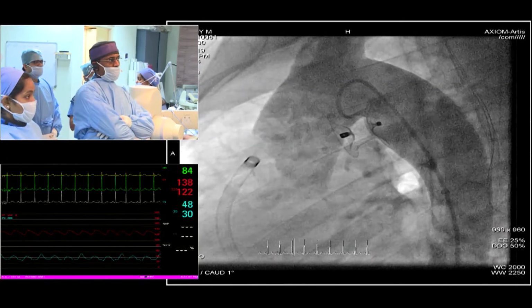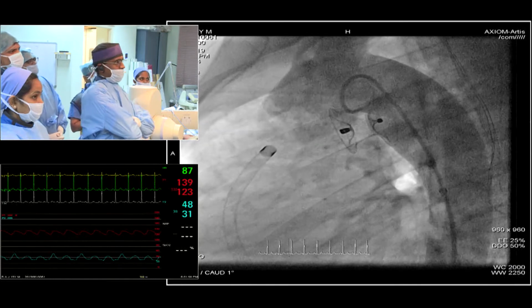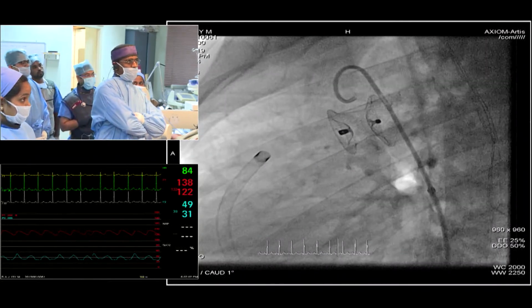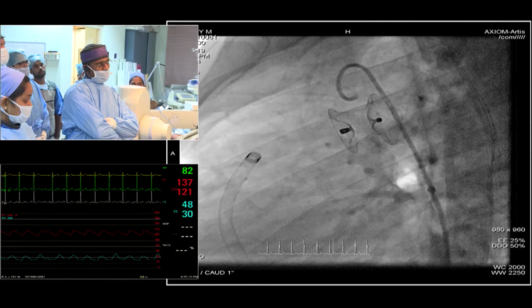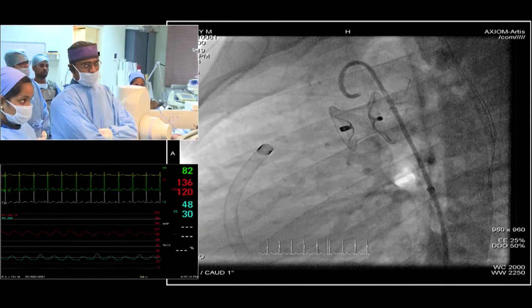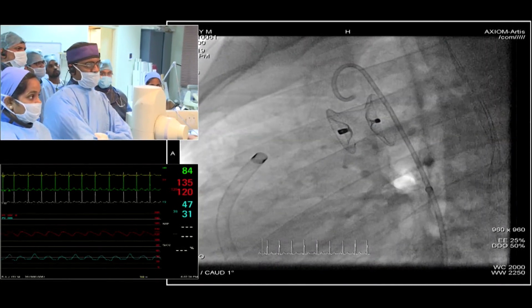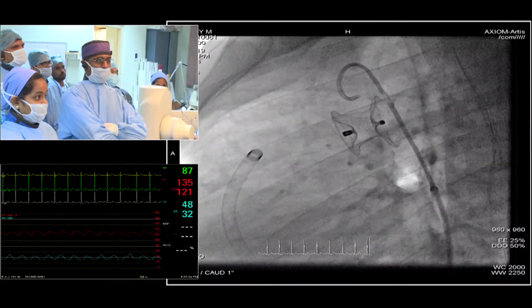So I went for a muscular VSD device, which is traditionally considered to be a safer device in a hypertensive ductus. However, I wanted the aortic disc to be a little larger than the PA disc, and such a customization of the device was feasible with some non-Amplatzer company. I think with your high pulmonary artery pressure, it's also important to have a disc on the right side. Exactly, so that the device doesn't rock. And you get a much better seal. Exactly. If I try to close this with a very large duct occluder, there will still be a lot of apprehension about the chances of reverse embolization. However, when we are putting a muscular VSD device, we get a comfort. We are playing in a comfort zone.